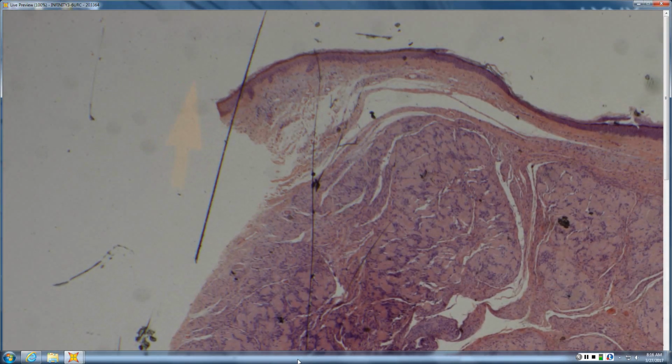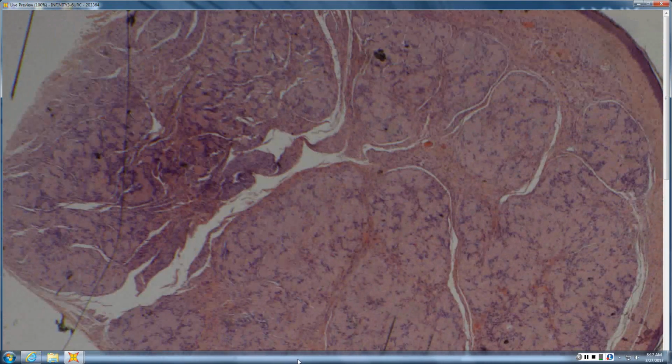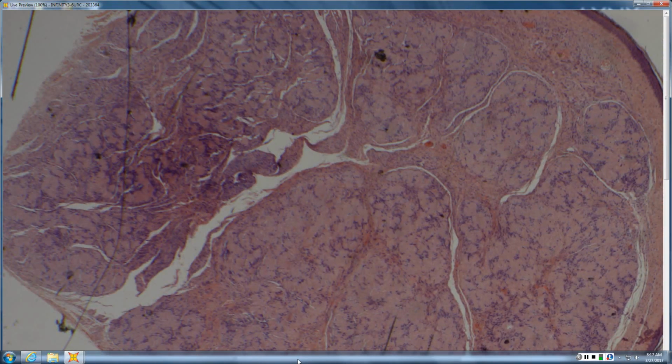Let's see. So it kind of has the pink color of a granular cell tumor, but it's not quite as nested as I would like. And what are all these Verocay bodies doing there? Something that's superficial, kind of vertically oriented and clefted. So, I think I could talk myself into some subcapsular edema, maybe like a schwannoma. But it's not deep and encapsulated. It's fascicles with clefts between them. It's just the fascicles are fat because of all those Verocay bodies. So it's a neuroma. So it's PEN.